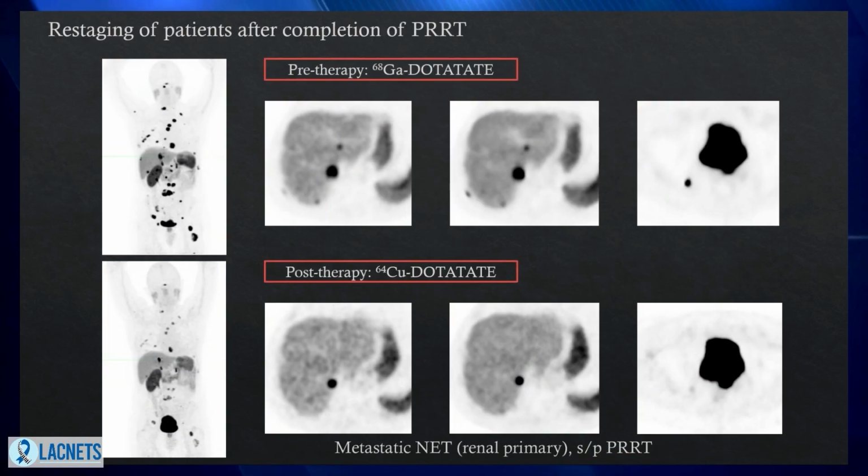Now, if someone was imaged with gallium dotatate initially, can they get their follow-up with copper dotatate? Ideally, it's good to stick with the same agent to have accurate and reproducible follow-up, but it is also possible to switch, and that's totally fine.